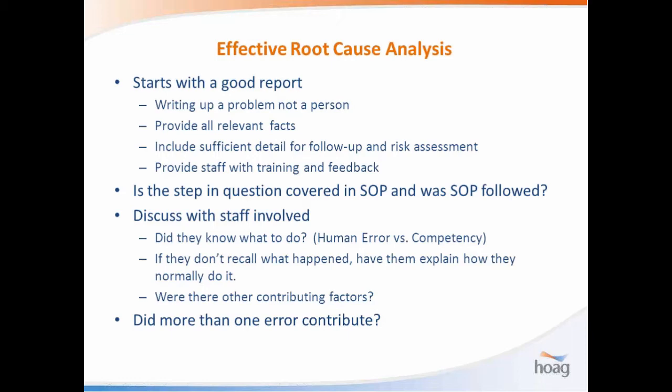They need to provide all the relevant facts and ensure sufficient detail for follow-up and risk assessment. It's important that we develop a training module for how to report in the OTIS system and provide them with feedback if they're not doing a good job. And I'm going to show you an example in a moment of a good report and a not so good report.